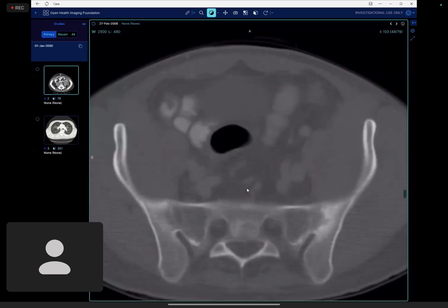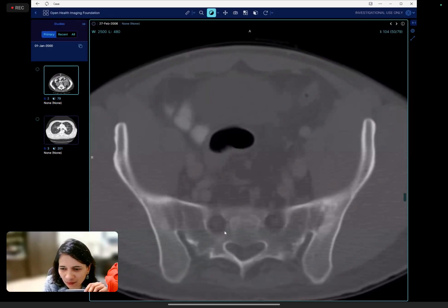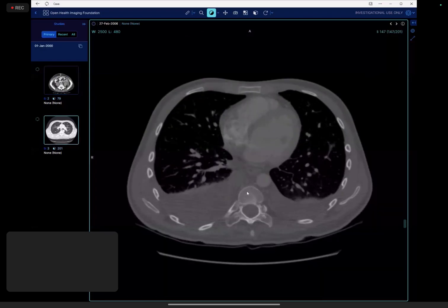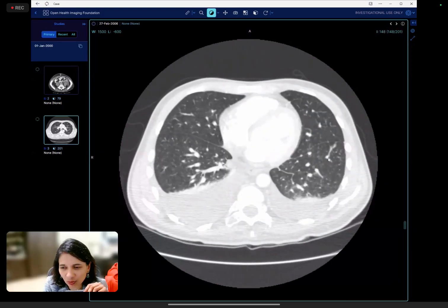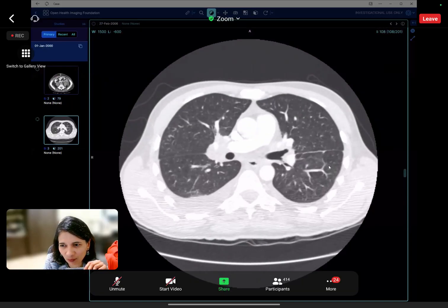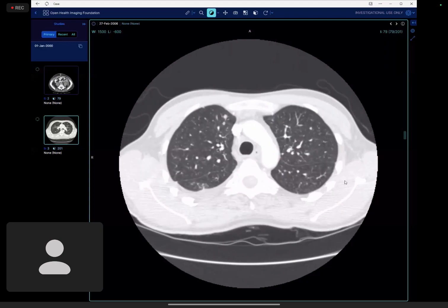Ankylosing spondylitis. Yes. And this patient is on anti-TNF, tumor necrosis factor, because of that immunocompromised and developed miliary tuberculosis. That's why he's unwell. That's why you have bilateral effusions, multiple lung pathologies, and lymphadenopathy as well. That's acute TB.